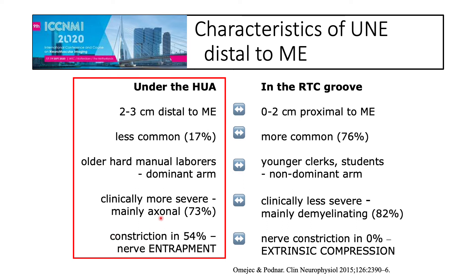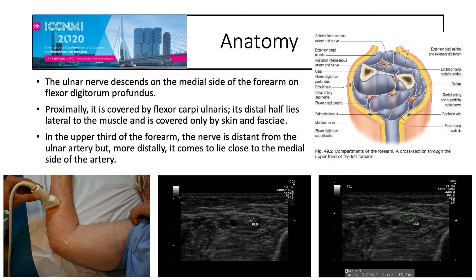The ulnar nerve then descends on the medial side of the forearm on the flexor digitorum profundus. Proximally it is covered by the flexor carpi ulnaris; its distal half lies lateral to the muscle, covered only by skin and fascia. In the upper third of the forearm the nerve is distant from the ulnar artery, but more distally it lies close to the medial side of the artery. This is the position in the mid forearm — here is the ulnar nerve and the ulnar artery just beside it.